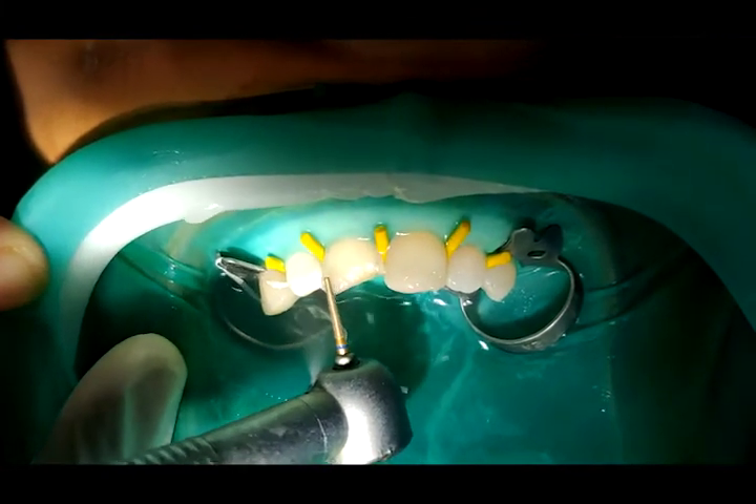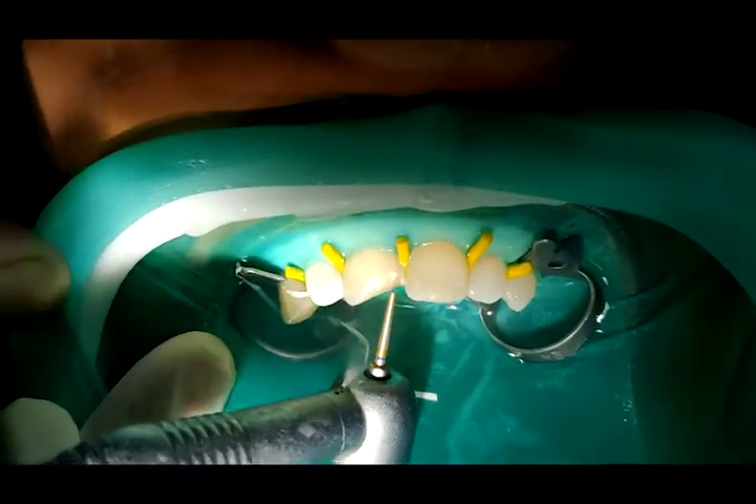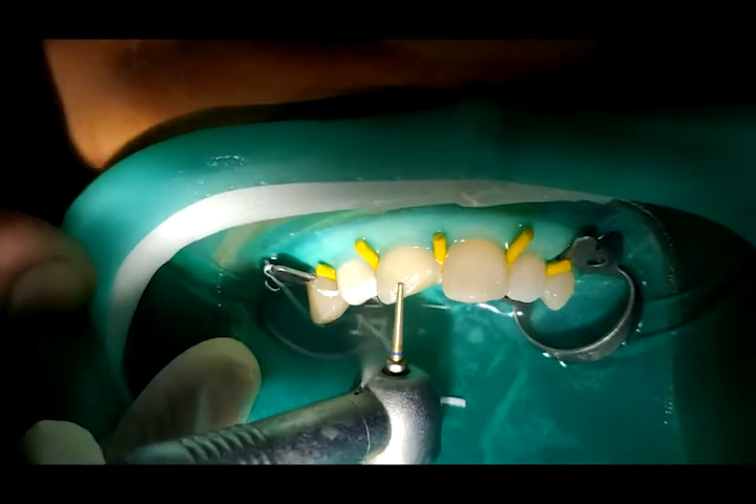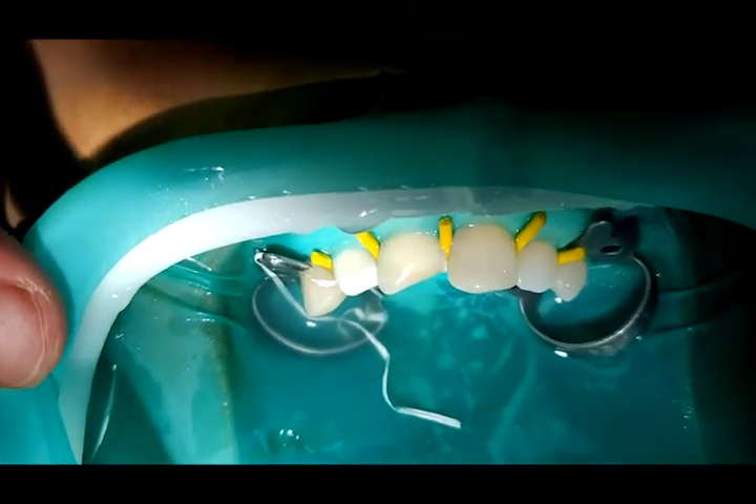The clinical tip to remember here is that if the enamel is very translucent, then create a long and deep bevel; and if the enamel is more opaque, then the bevel should be short and less pronounced.